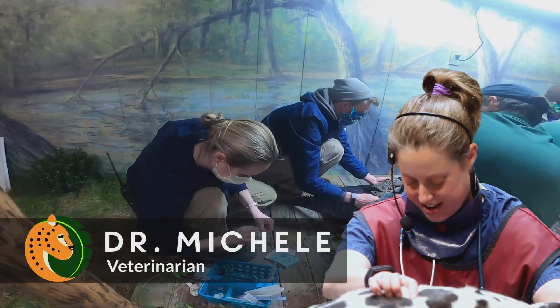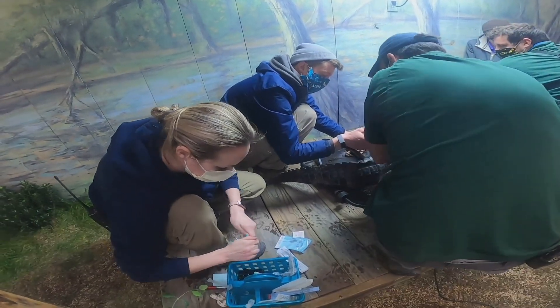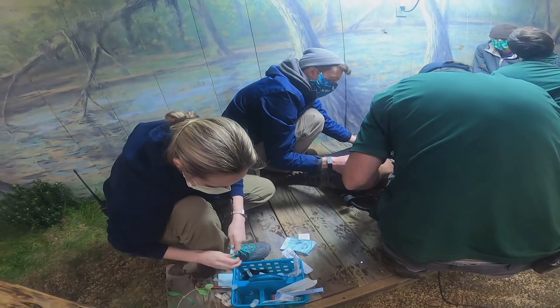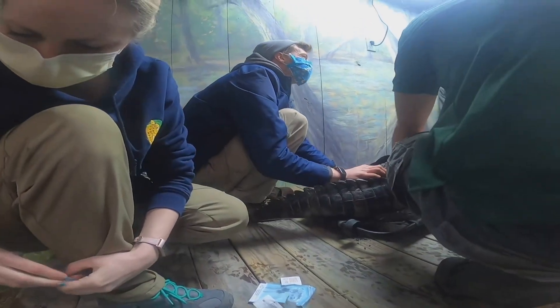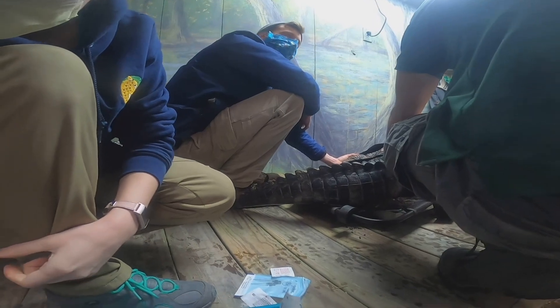Hi, I'm Michelle, the veterinarian here at the Elmwood Park Zoo. Today we're going to show you how we collect blood from several of our zoo animal species. You will see Courtney, one of our veterinary technicians, collecting blood from Penny the alligator, Daruba the giraffe, and Zian the jaguar.